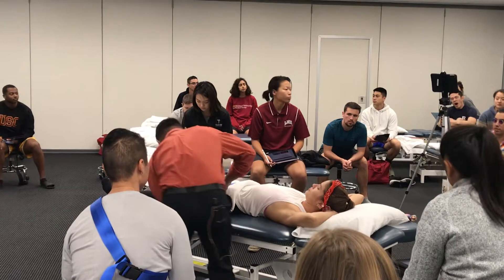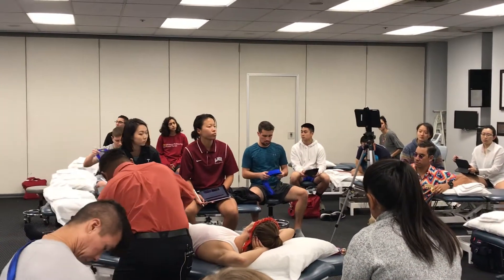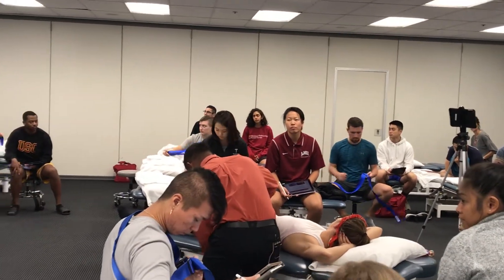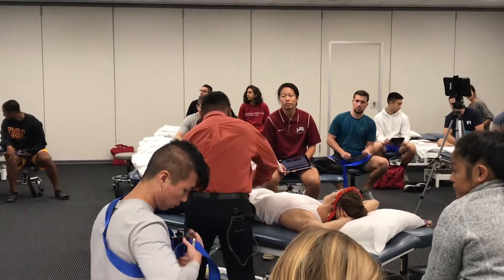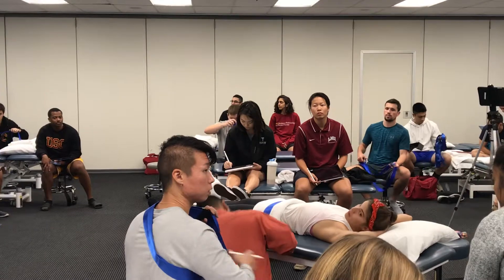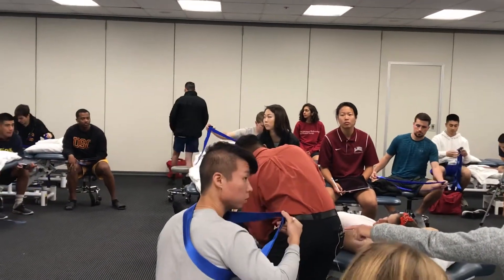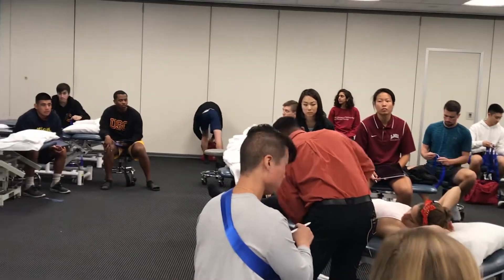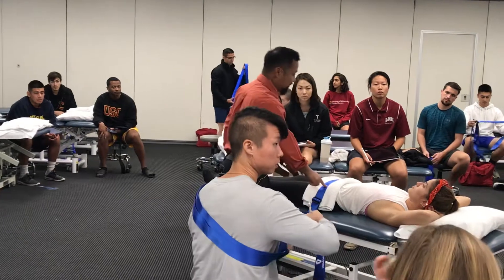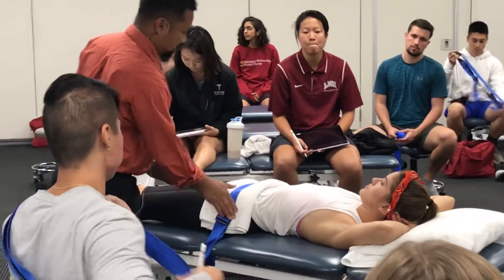With this kind of belt, to tighten it, you've got to pull that other plastic piece. I want to make sure that this strap is nice and tight — some of those are easier to tighten than others. I want to make sure that it's underneath her ASIS. That's going to create some sort of stability for the patient.